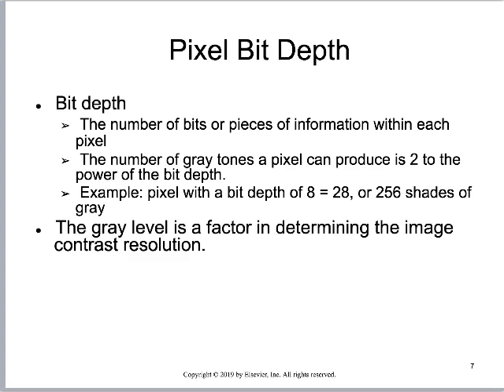This thing, bit depth, is different. This is a computer thing, right? This is not something that I can look at and say, that's the way I think about things, because I do not think about things this way. But what's nice is since you've had this training as an X-ray tech, you have a really ready way to understand this, right?